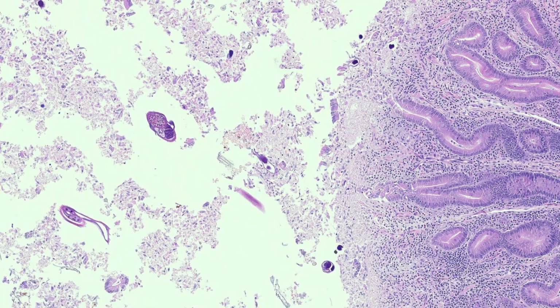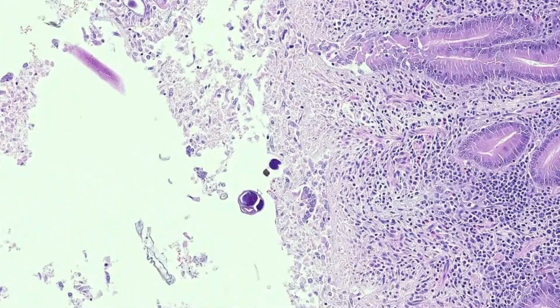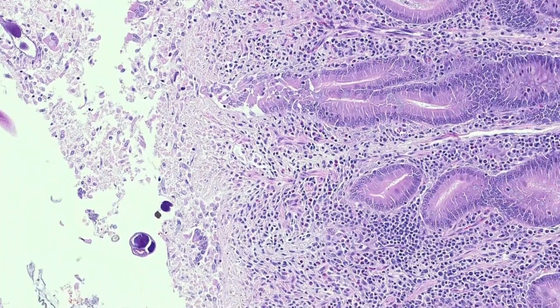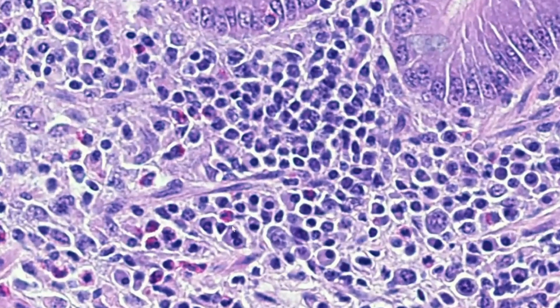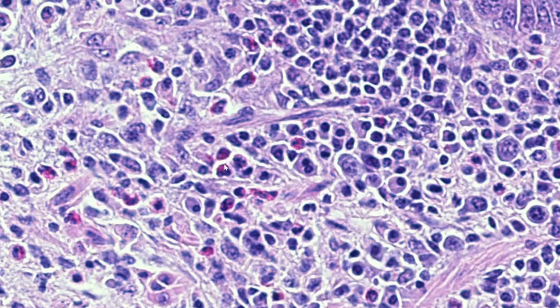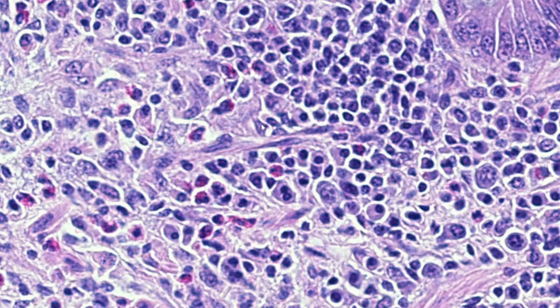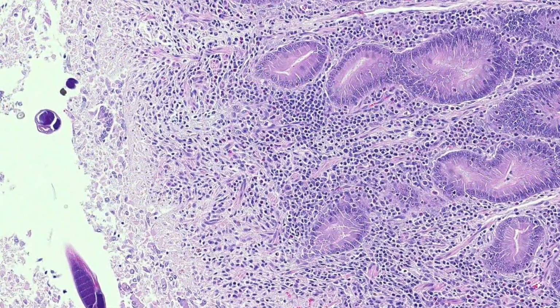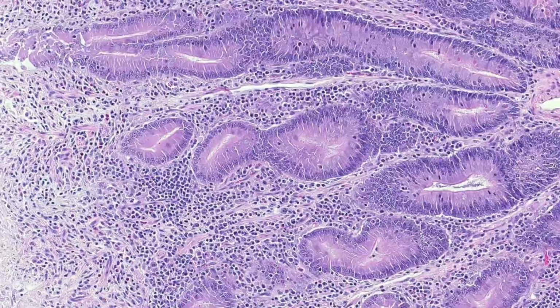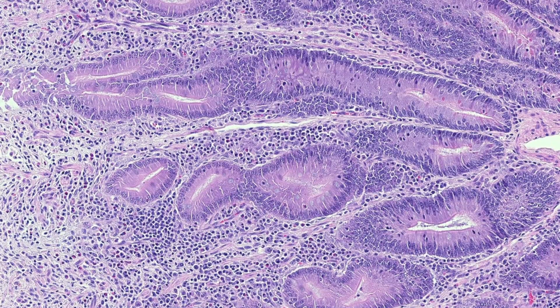And if we switch to this section of intestine from a sheep, we can see lots of intestinal parasites. So we'd expect there to be some eosinophils within the inflammatory component. And if we zoom in, here we've got some multi-lobed cells with pink granules in their cytoplasm. So these are eosinophils. In cows and sheep, the eosinophils are quite subtle, especially on scan slides.